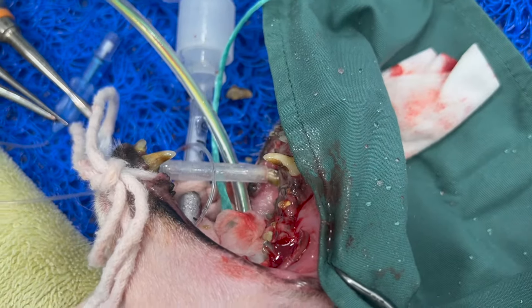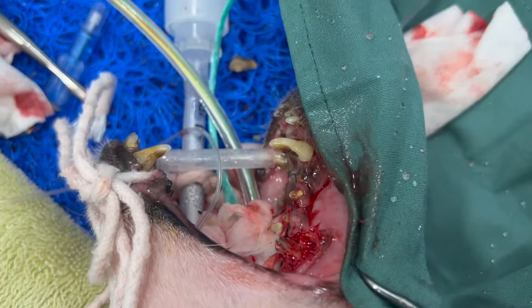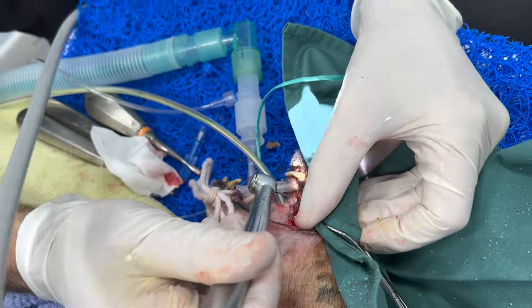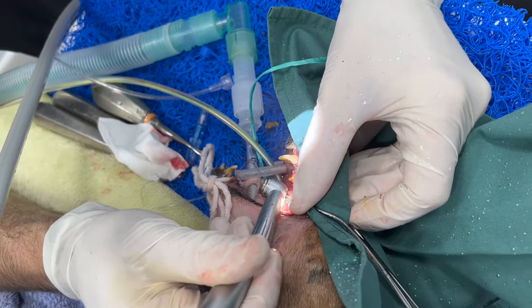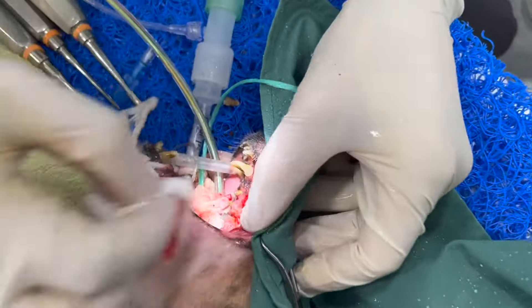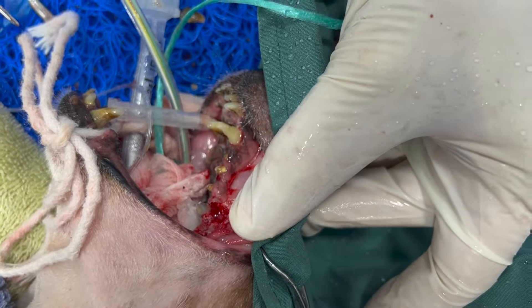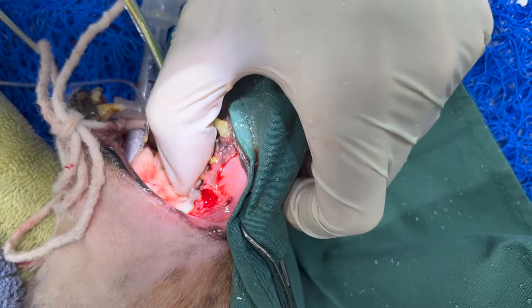You can see the final root is still there, and we're going to work on getting it out now — drilling a little bit more. You might be able to see the tooth is discolored. The root is discolored because this is a dead tooth — the pulp cavity has been exposed. It's a non-vital tooth.